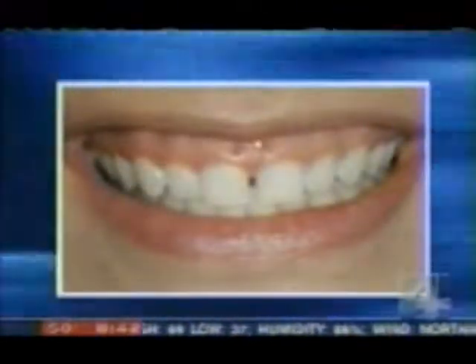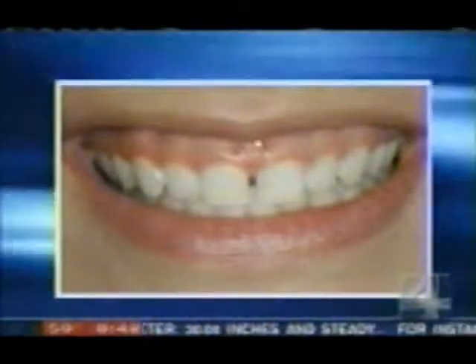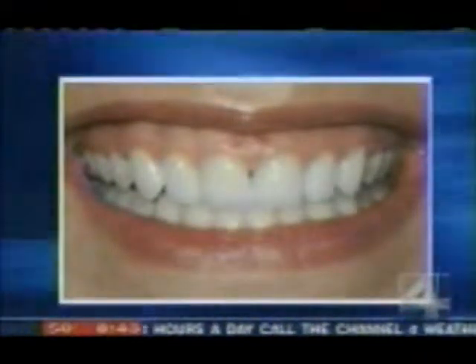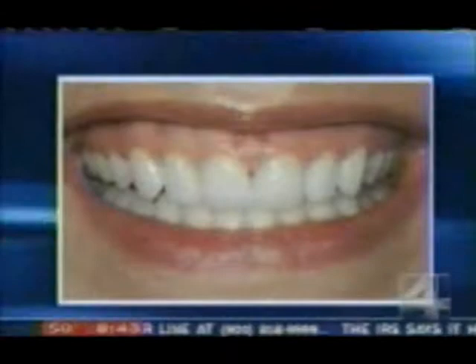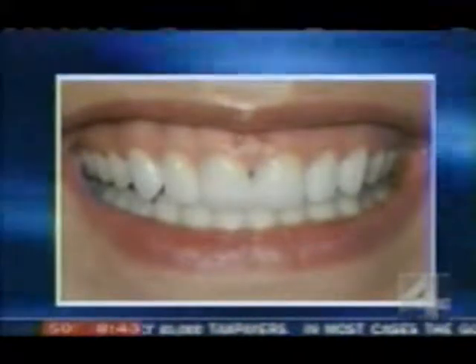Absolutely, that looks nice. Next picture that we're going to see, tell us what we're going to be taking a look at here. This is actually a more simple case. We've got about 8 veneers here, but we also did some laser therapy. So the veneers ended up closing the gap, and we got some better spacing across the front. But the laser therapy actually decreased the amount of gums we see in this situation. So you'd have to kind of toggle back and forth to look at the gums. It makes the teeth look a little bit longer. Oh, I noticed that, definitely. That looks nice. All right, next picture, please.